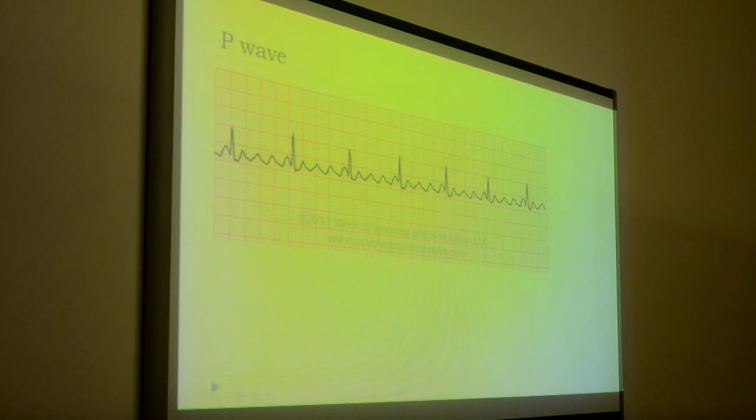One. Like tachycardia, but for sinus. No. Wait. You want to say tachycardia? I can tell right now it's not tachycardia. Look, 1, 2, 3, 4. This is not only two. That's why you use the QRS complex when you want to measure the heart rate. But you are correct. The atrial heart rate is very fast.